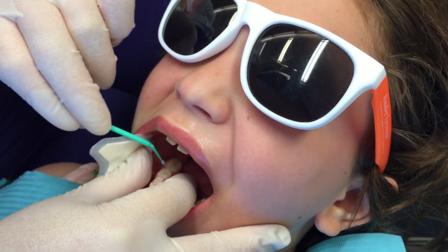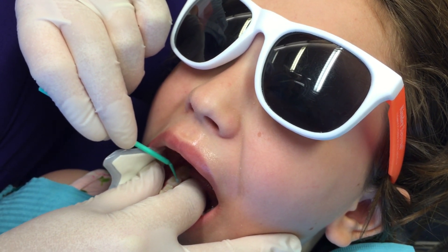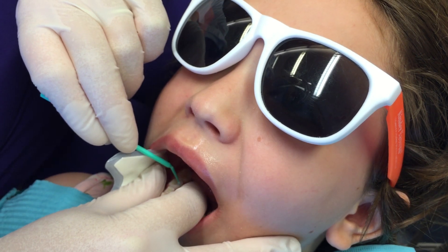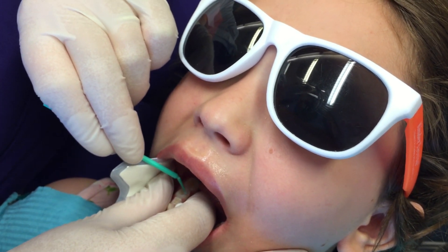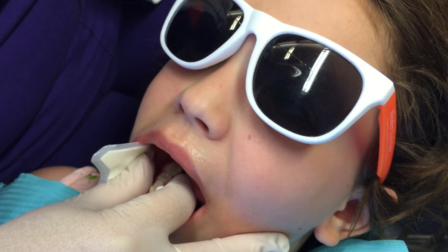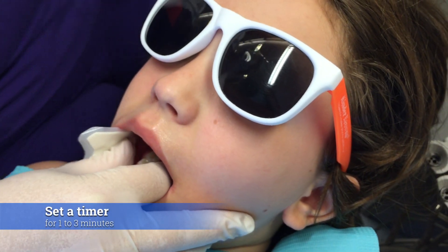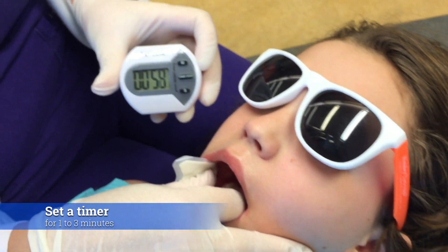Now we're going to apply it with a micro brush for one minute. Try not to allow it to get on their tongue. The flavor is rather unpleasant.